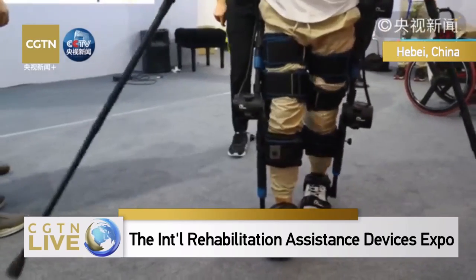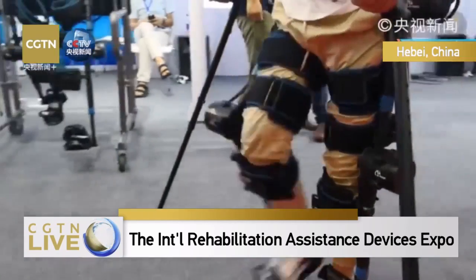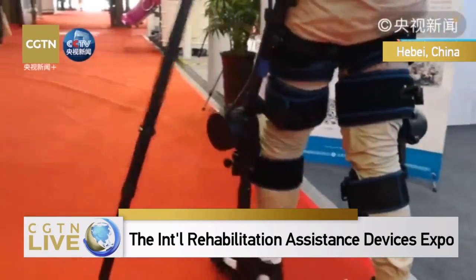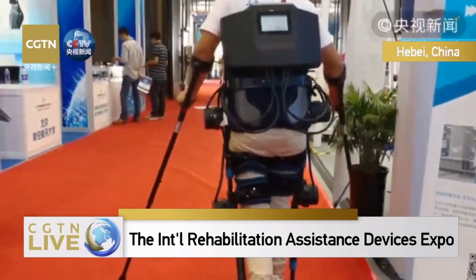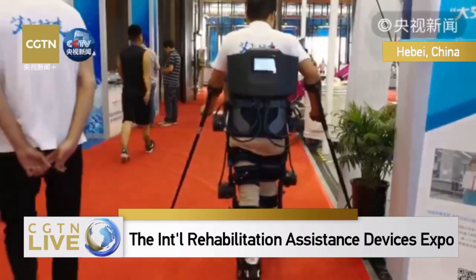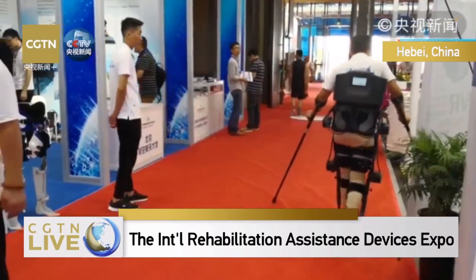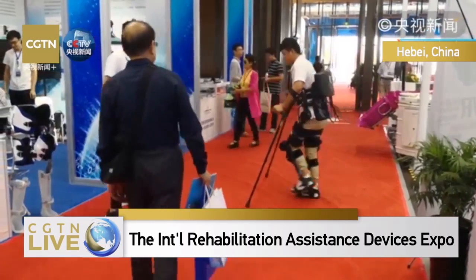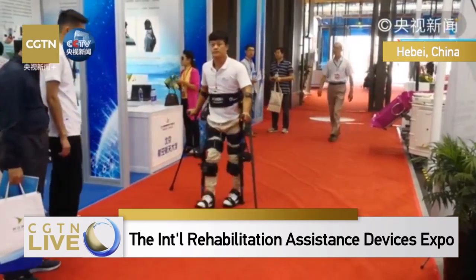It's about 20 kilograms in weight. A setting can be applied here, helping the patient to walk with the assistance.